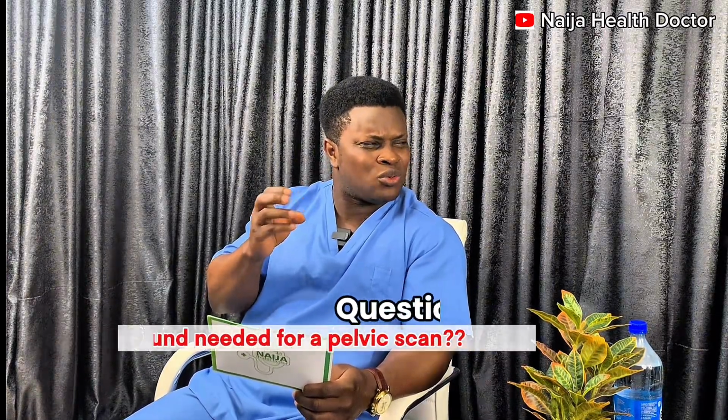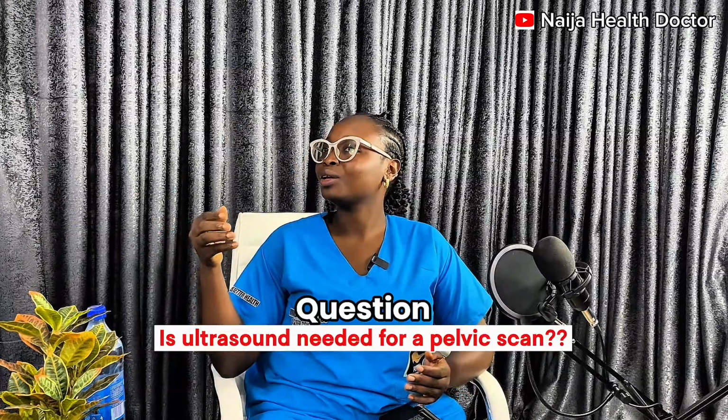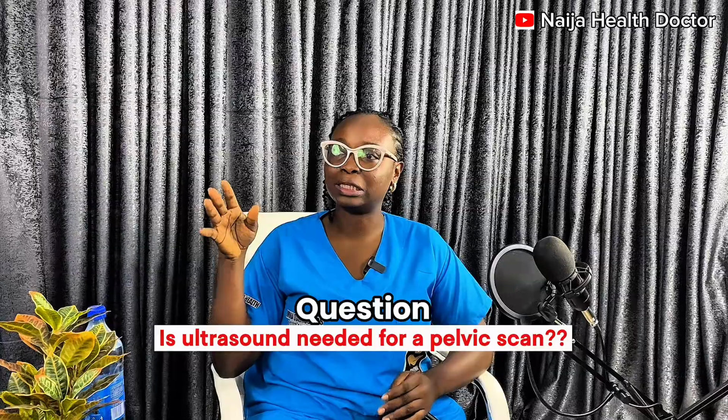pelvic scan. For pelvic scan, do we need to use ultrasound? PCOS, I mentioned earlier, you can use pelvic scan and you can use transvaginal scan. I'm coming back to that. So you can use pelvic scan to check for early pregnancy, from 6 weeks to 12 weeks. It's going to be visible. You can use pelvic scan to check for fibroid. You can use pelvic scan to check for endometriosis.